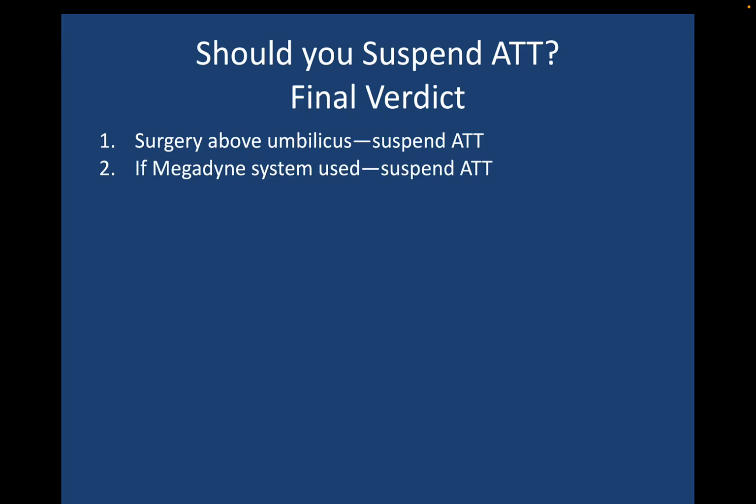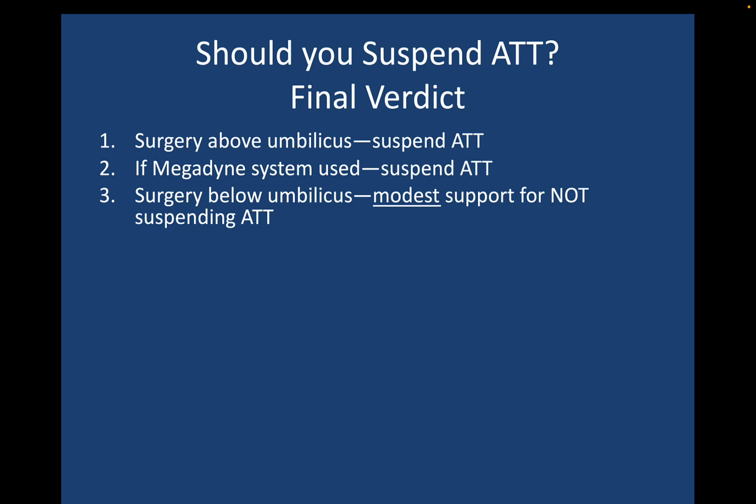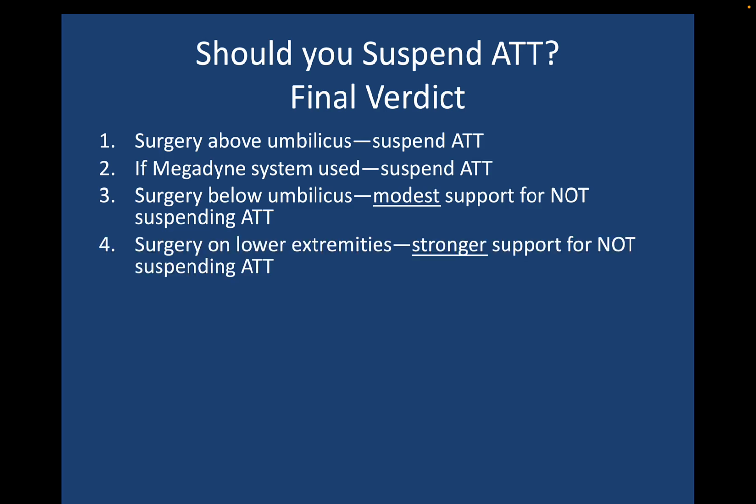All right, so what's the verdict with all this information I'm throwing at you? Number 1, surgery above the umbilicus, it's crystal clear, suspend the anti-tachytherapy. Number 2, if the Megadyne system is used, suspend anti-tachytherapy. If surgery is below the umbilicus, there's modest support for not suspending the anti-tachytherapy. If the surgery is on the lower extremities, there's stronger support to not suspend the anti-tachytherapy.